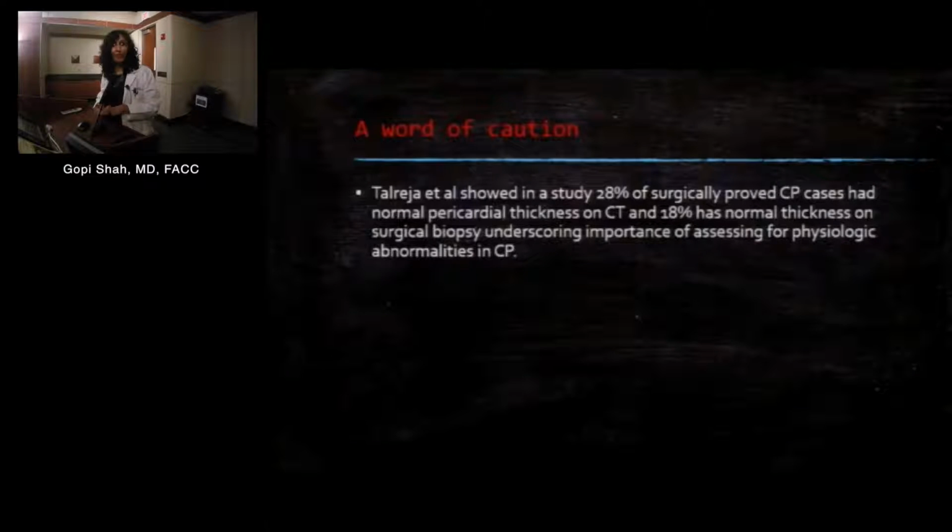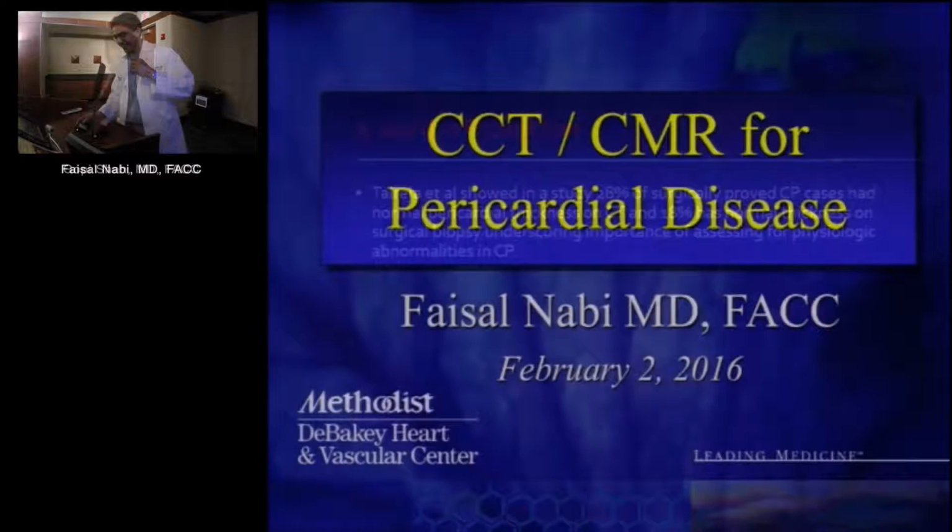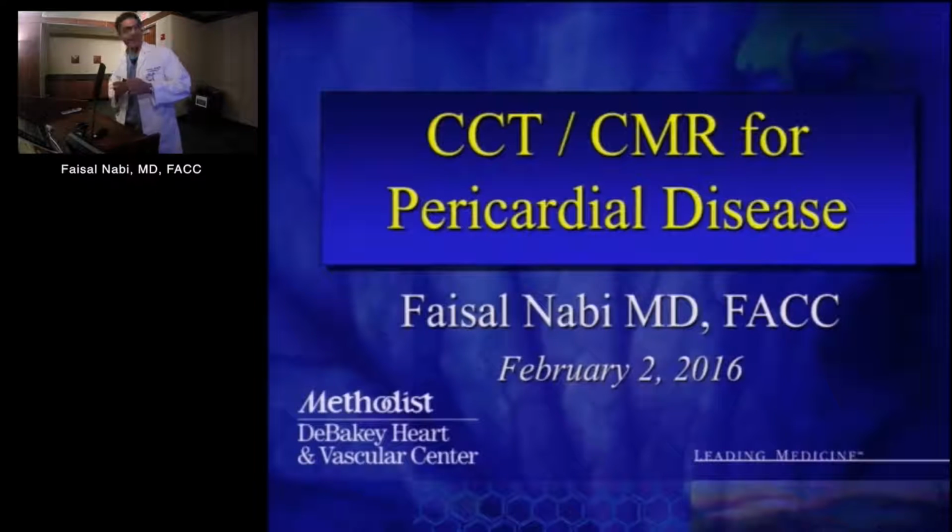And obviously that is where the clinical presentation of the patient and the hemodynamic data that we get from echo and MR are very important. A great talk by Gopi, and I think she covered all the very important aspects of this disease. My job is to reiterate some of the things she has mentioned, and also to show, specifically for CT and CMR, some of the features that we look for that suggest these different disease processes. And I'll move quickly.